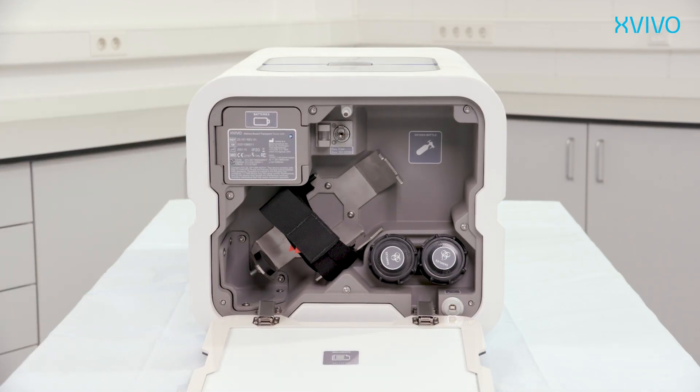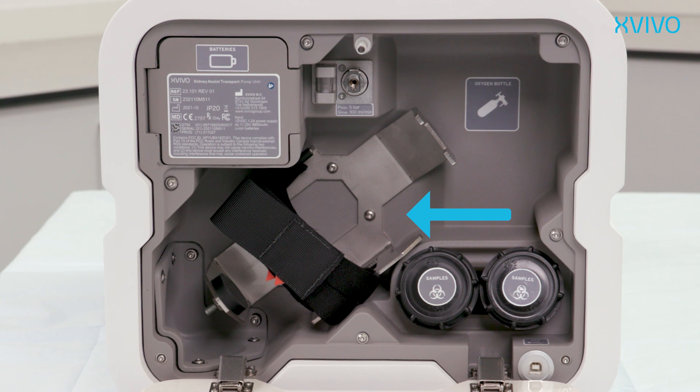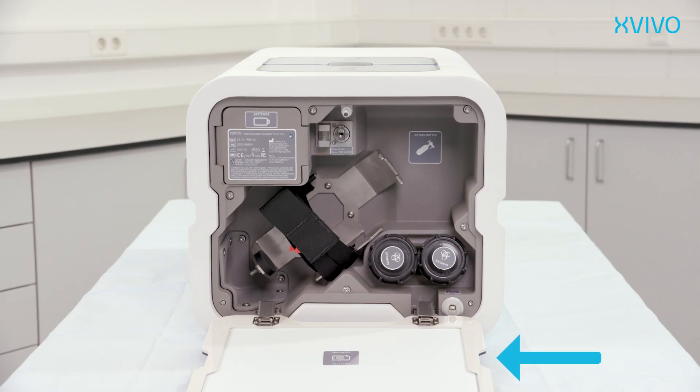Behind the compartment door the following components are accessible: battery compartment, holder for an oxygen cylinder, oxygen connection with safety valve, oxygen flow indicator, storage space for sample tubes which can be used for cross-matching materials, and an access port for data retrieval and servicing. Behind the transparent window of the compartment door you can store the organ identification documentation.